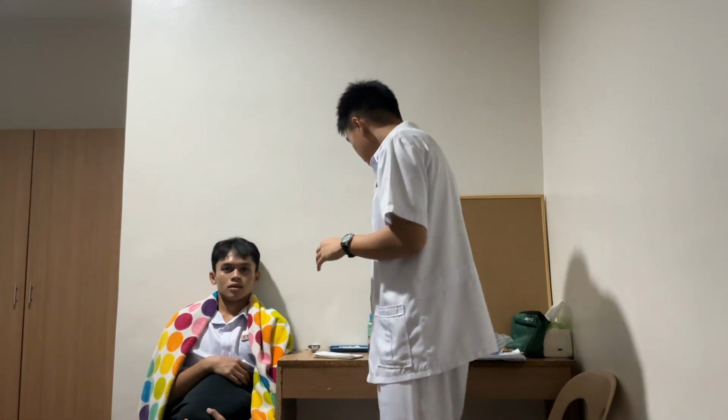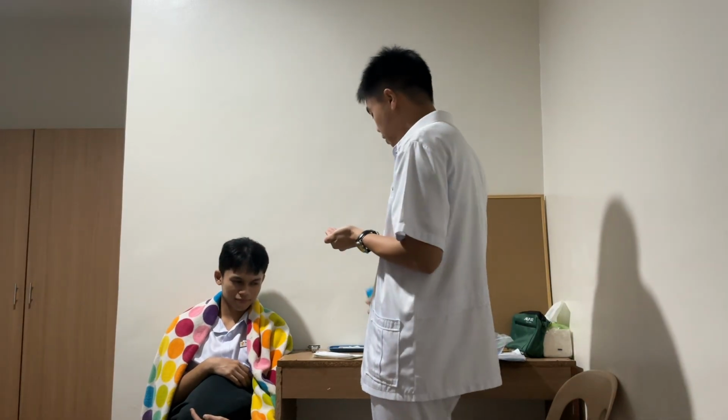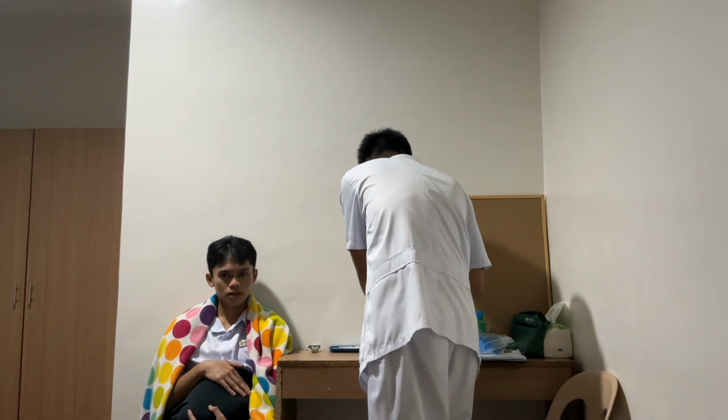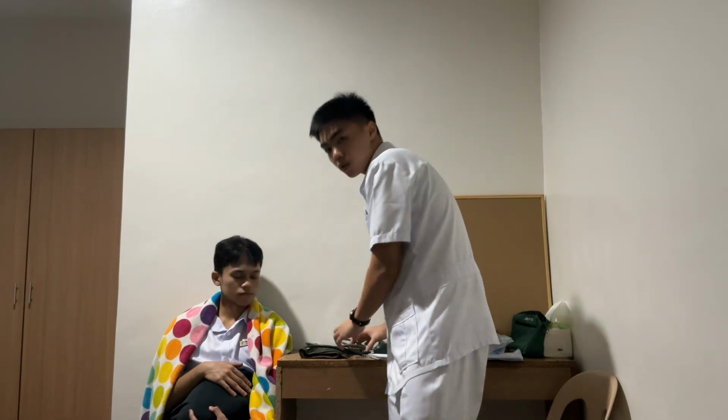Okay, so first I will be ensuring that everything is intact. Since I touch the patient, of course you can do hand washing and hand hygiene as frequently as possible. So materials needed: of course, the sphygmomanometer and the stethoscope. So with that, everything should be intact and everything should be functioning.